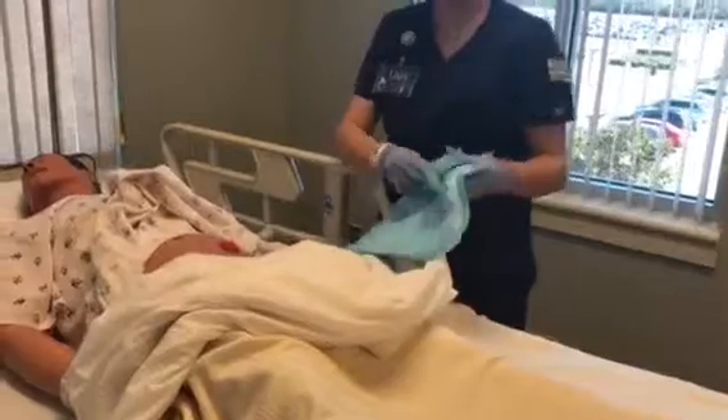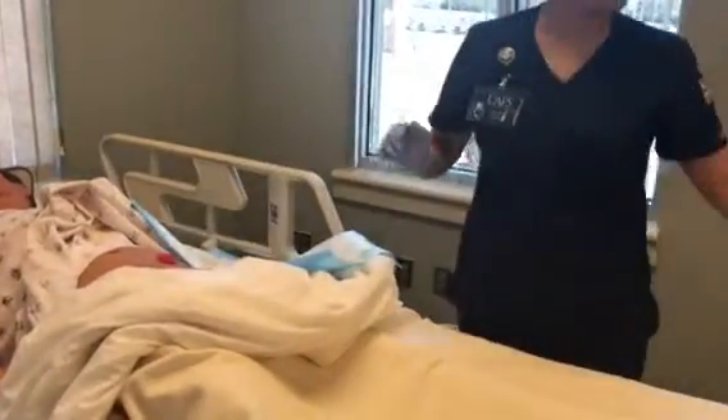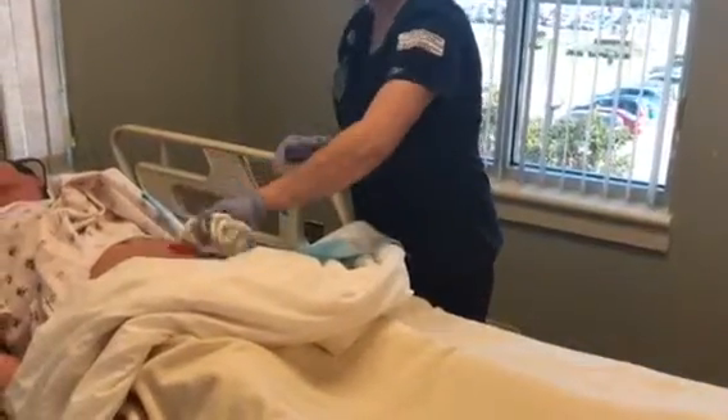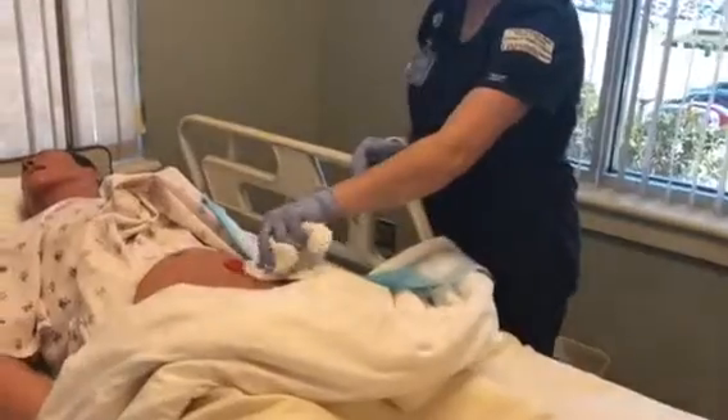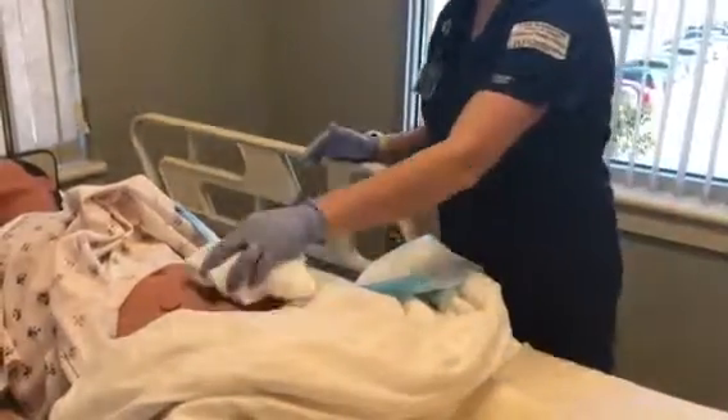I'm just going to lay this down across you. I'm just going to clean around the area, and then dry it off.